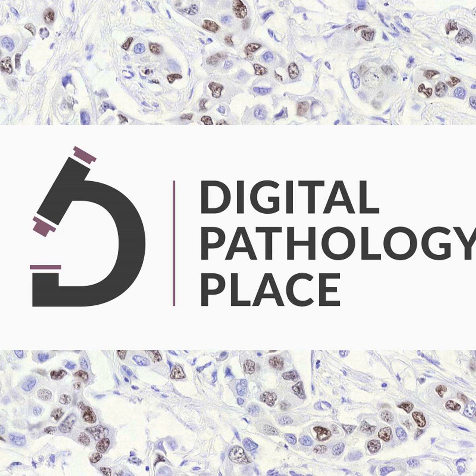It's not a tumor. With a tumor you have it in one place and the rest is free. So if you take a biopsy here, you don't biopsy your tumor, whereas if you take your biopsy here, this is my biopsy needle, then you will have tumor. Tumor heterogeneity is a lot more pronounced than the heterogeneity of fibrosis in the liver, which should be distributed homogeneously. So I would also not anticipate that biopsy position and orientation will influence it, but you have to check that, because if it's your diagnostic modality, you have to account for all these things.